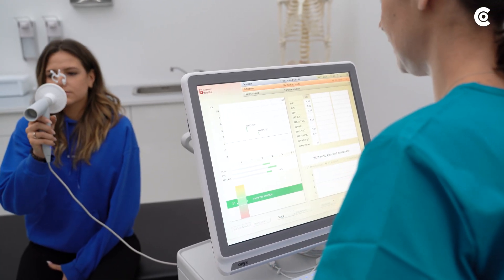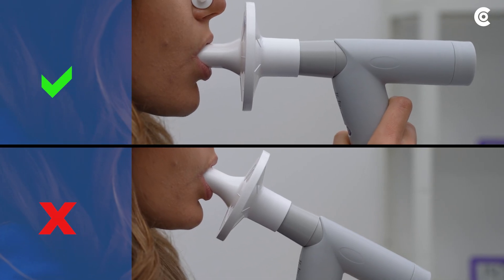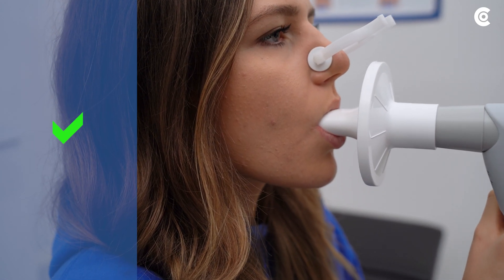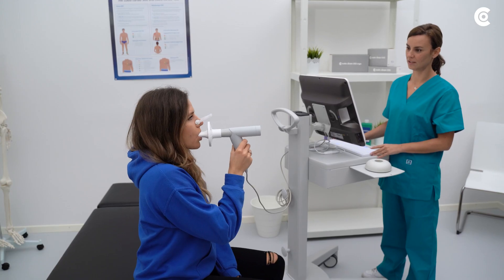Verify that the SpiroMobile is used in the correct position. When used incorrectly, the device will produce incorrect results or no results at all. The mouthpiece must be fully enclosed by the patient's lips. Verify that no air can escape from the corners of the patient's mouth.